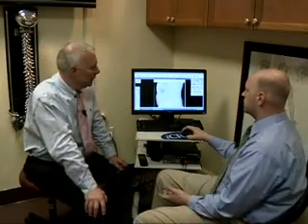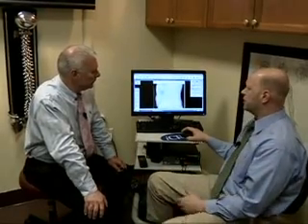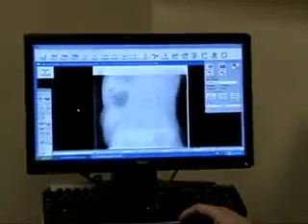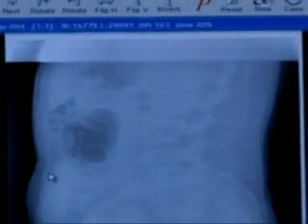And again, this is another aspect of what I love about changing the quality of the image. I had an athlete in here that was complaining of back pain, and he's had some treatment before, unexplained back pain, it's just recurring. If we took this image, it's slightly underexposed here, and we say, well, we kind of see it, we could get a good enough image where we can see the spine.